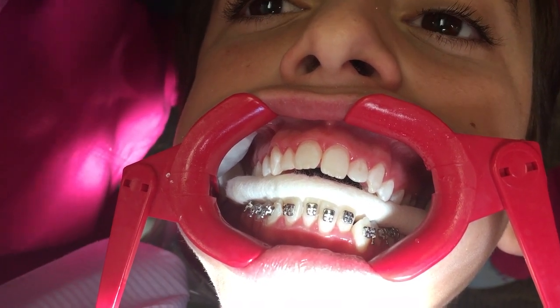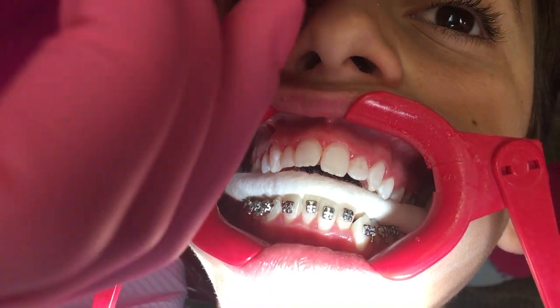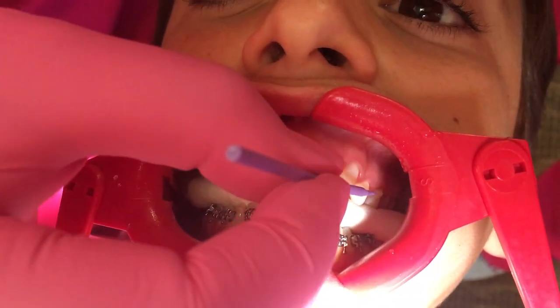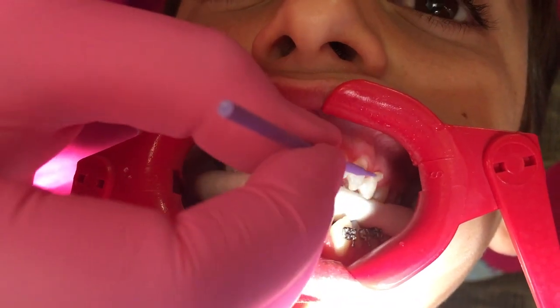Remember, painting from gingival, add to the top, like a painting movement. Perfect. Welcome to the office.